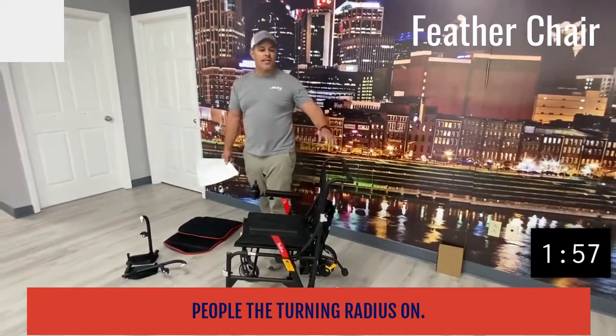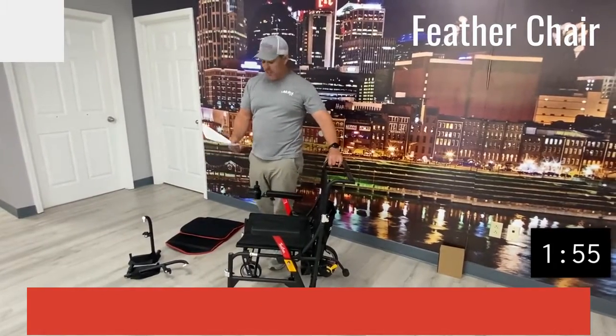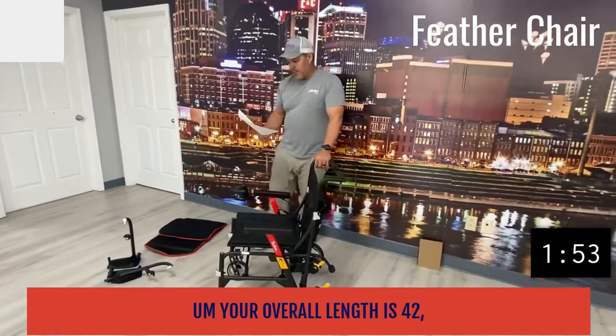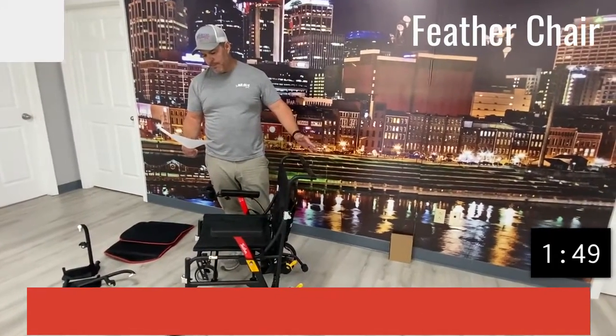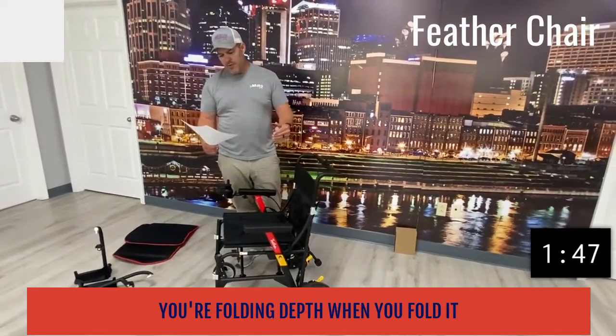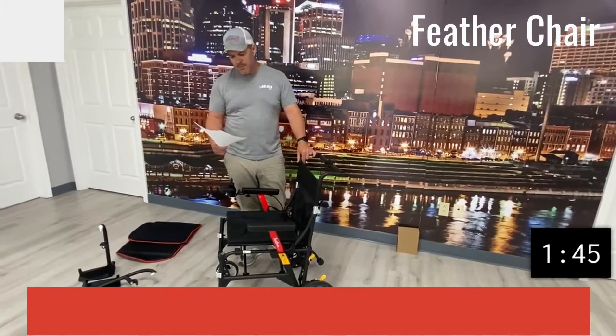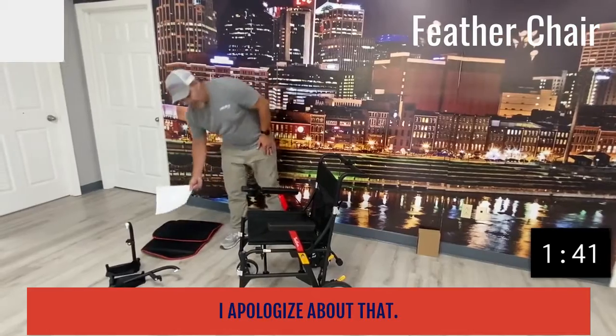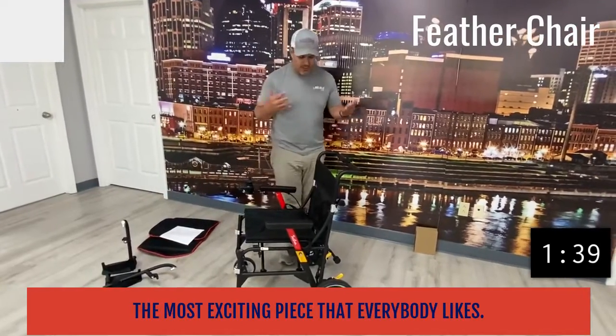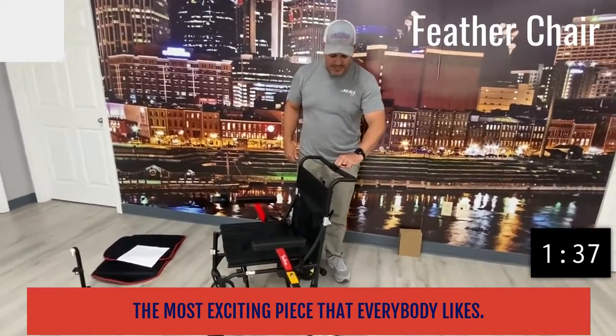The turning radius on this is 38 inches. Your overall length is 42 inches, and your folding depth when you fold it up is 14 inches — that's the most exciting piece that everybody likes.